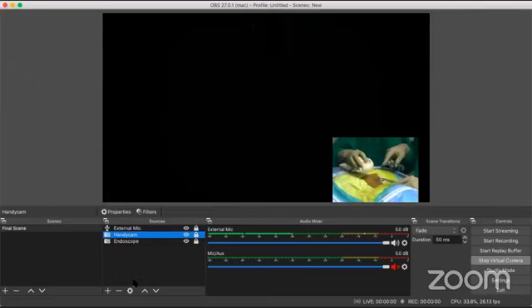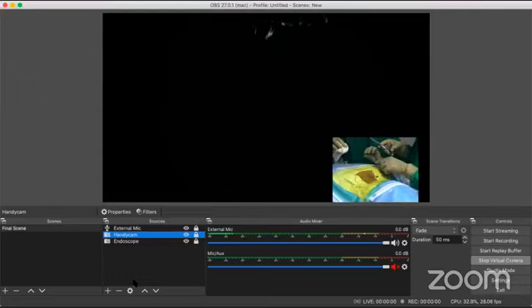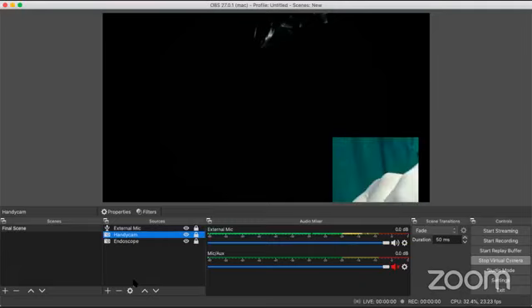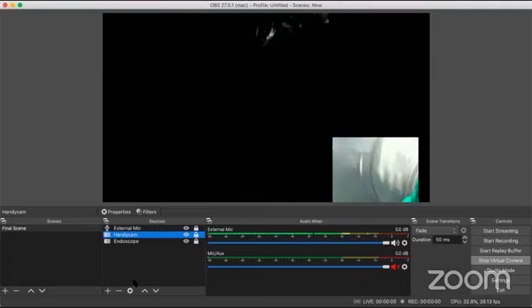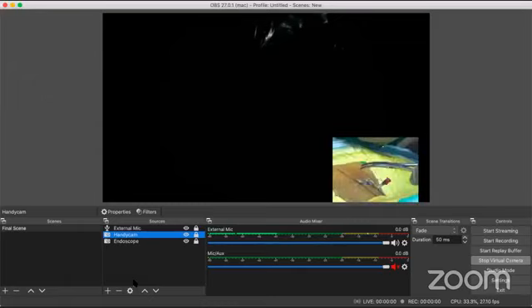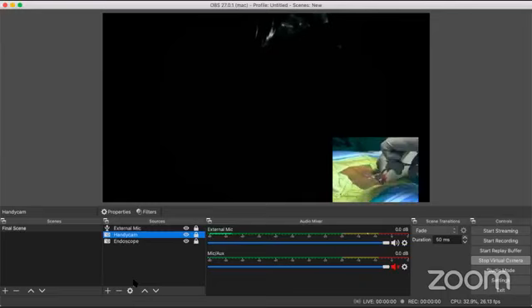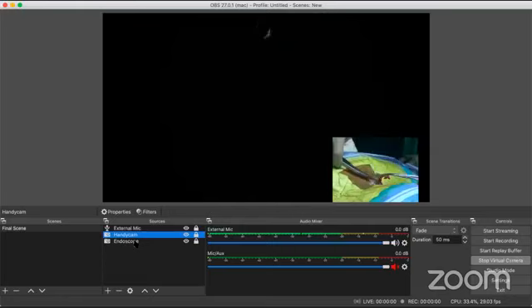Sorry, this is a little boring part of the surgery, but the most essential part, because we don't want to carry any plastic tissue into the wound while we are operating. Out with the needle. And this is the non-endoscopic part of the surgery.